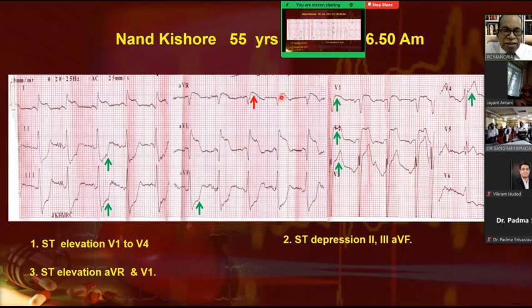So the differential is between a proximal triple vessel disease or a very proximal LAD occlusion or a left main occlusion. Now, if the ST elevation is more in aVR compared to V1, this becomes a left main stem disease. But if it's the reverse, this is not left main disease. This is either a very proximal LAD or a triple vessel disease. And if you look at ST segment elevation in 1 and aVL, there is ST elevation clearly indicating this patient has an infarct of the left anterior descending, and this patient has an infarct of the circumflex territory.